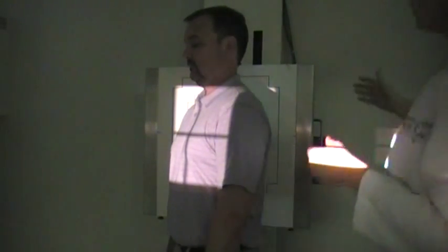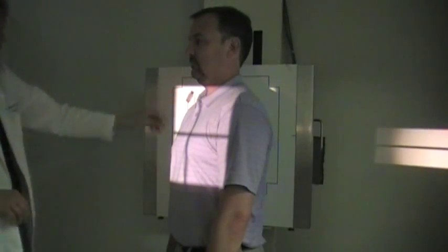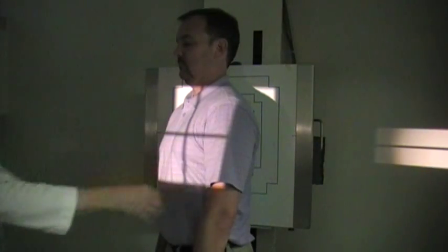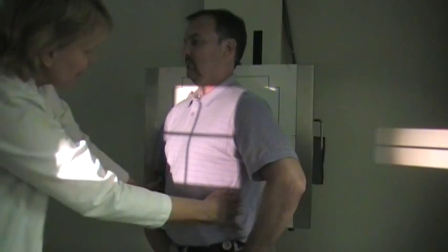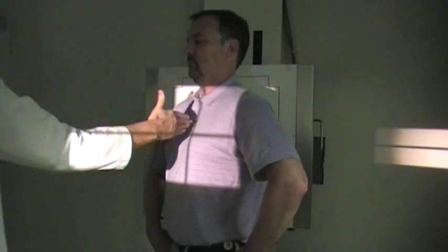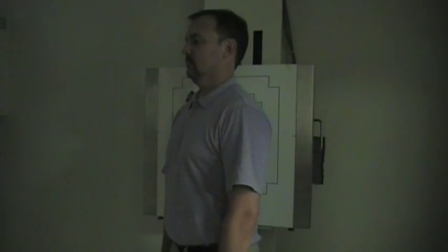For the right oblique, have your patient 45 degrees. Right side is touching. We're going to place our right marker up against here. Okay, and then I'm going to readjust, lean David just a little bit forward so that we can make sure that we are getting both sides of the lungs on. So you want to check your light field, and it's going to look like this, longitudinal light is on the upside from the midpoint of the chest. But it's real important we do include both lungs on this.